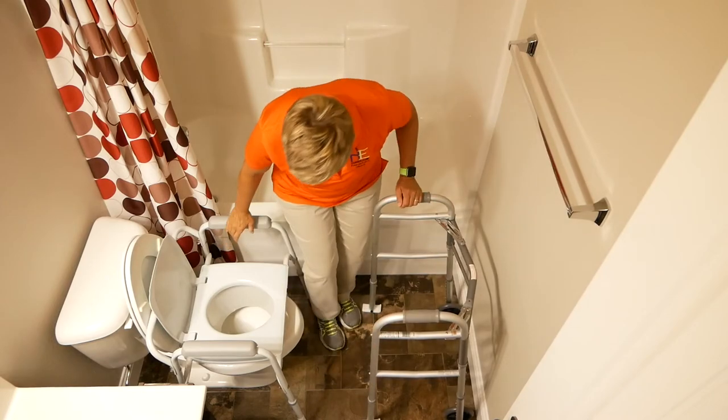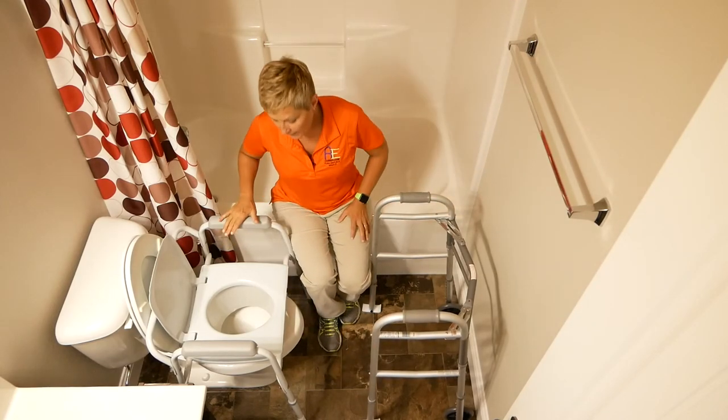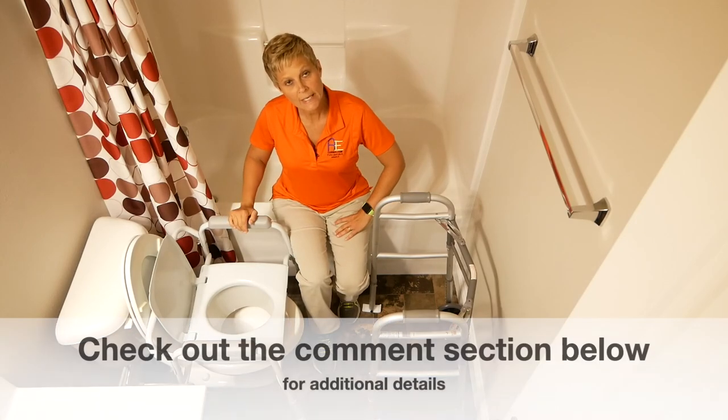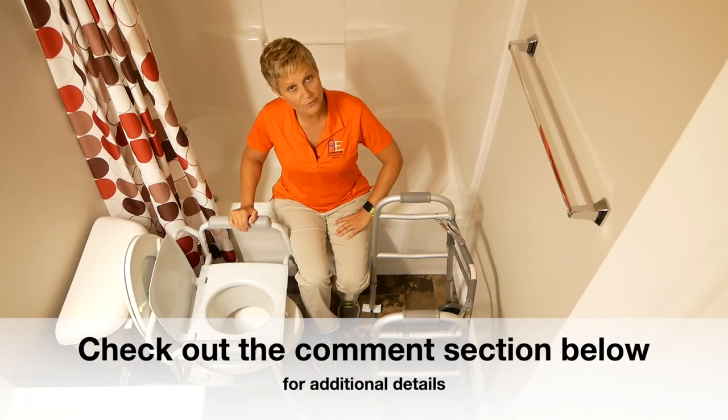So that's how you use the bedside commode frame over the toilet, giving someone verbal cues in doing so. Take a look at the comments section below for further details.